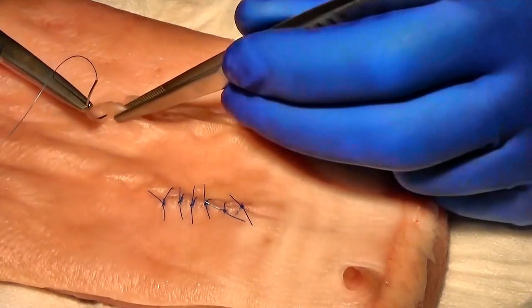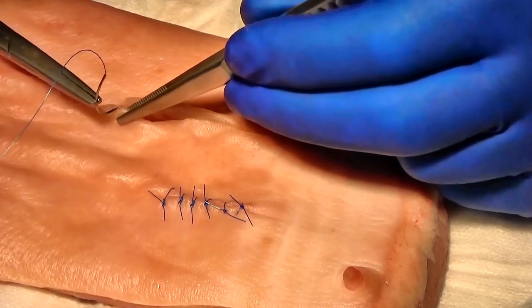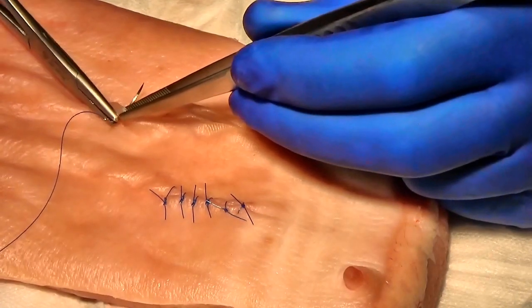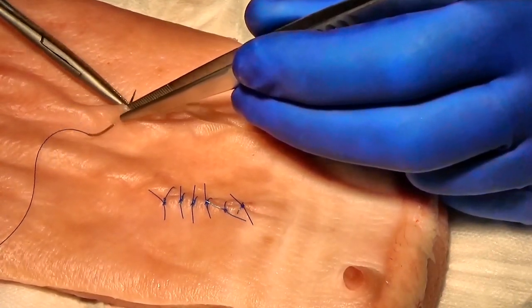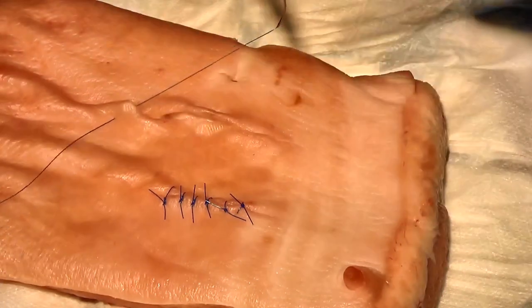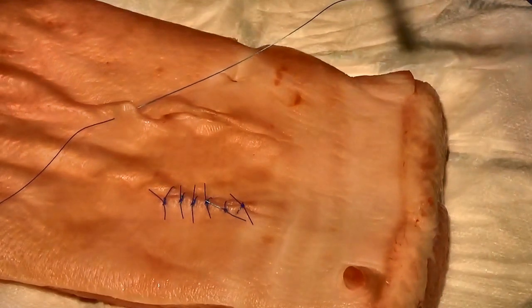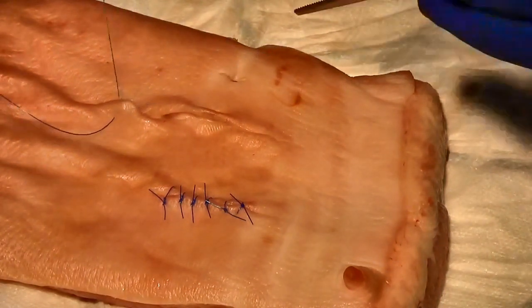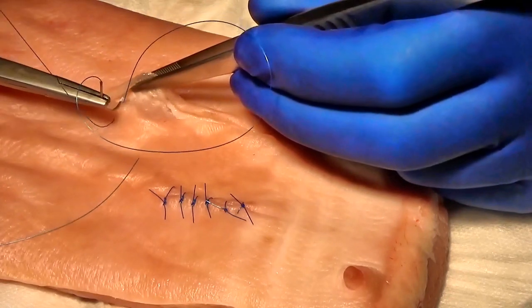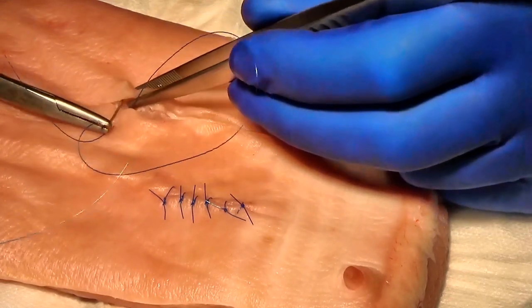You start again putting the needle through the skin at 90 degrees, slightly further out than you would do for a simple suture. So through the skin at 90 degrees, further away than you would have done for a simple suture.